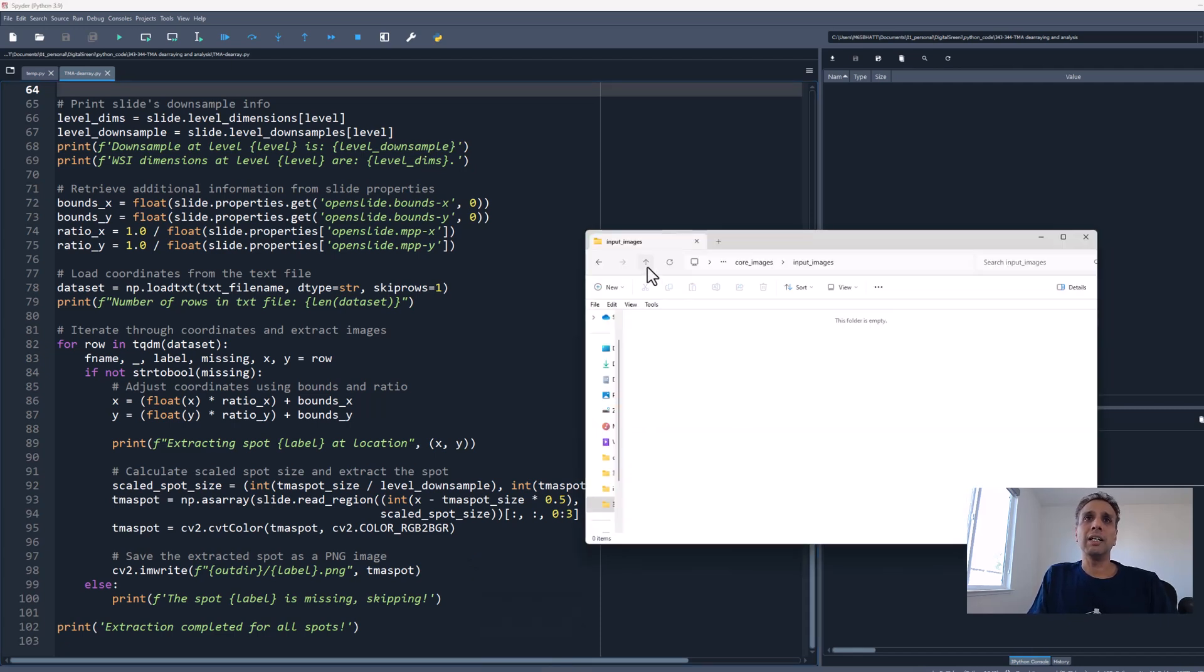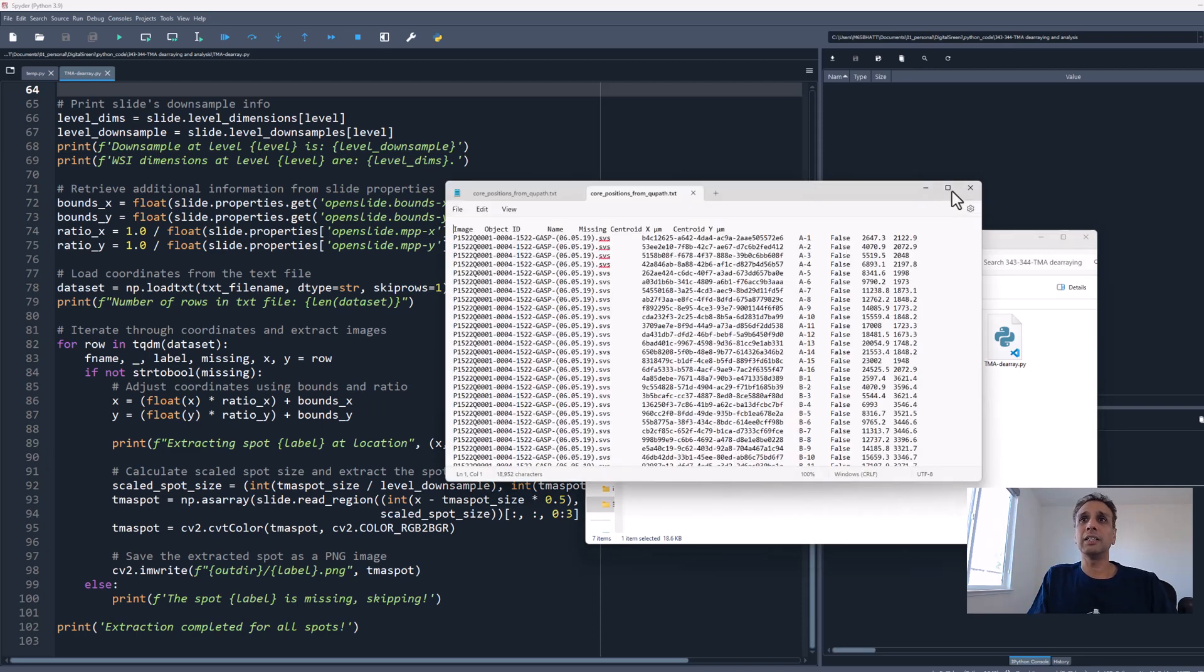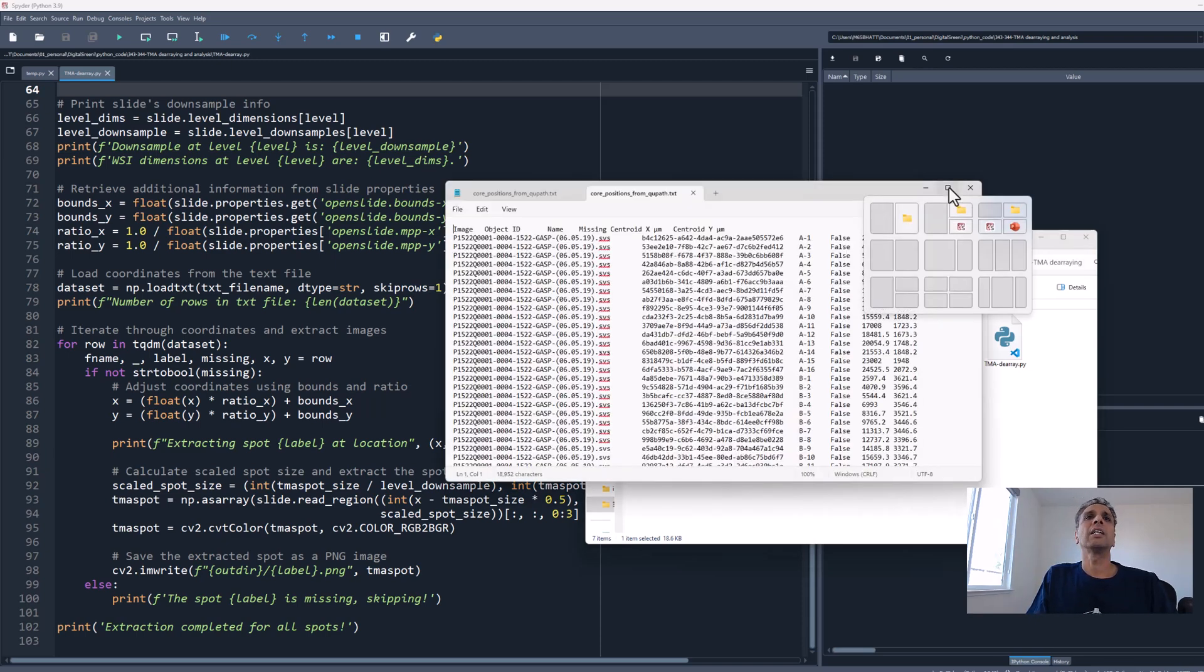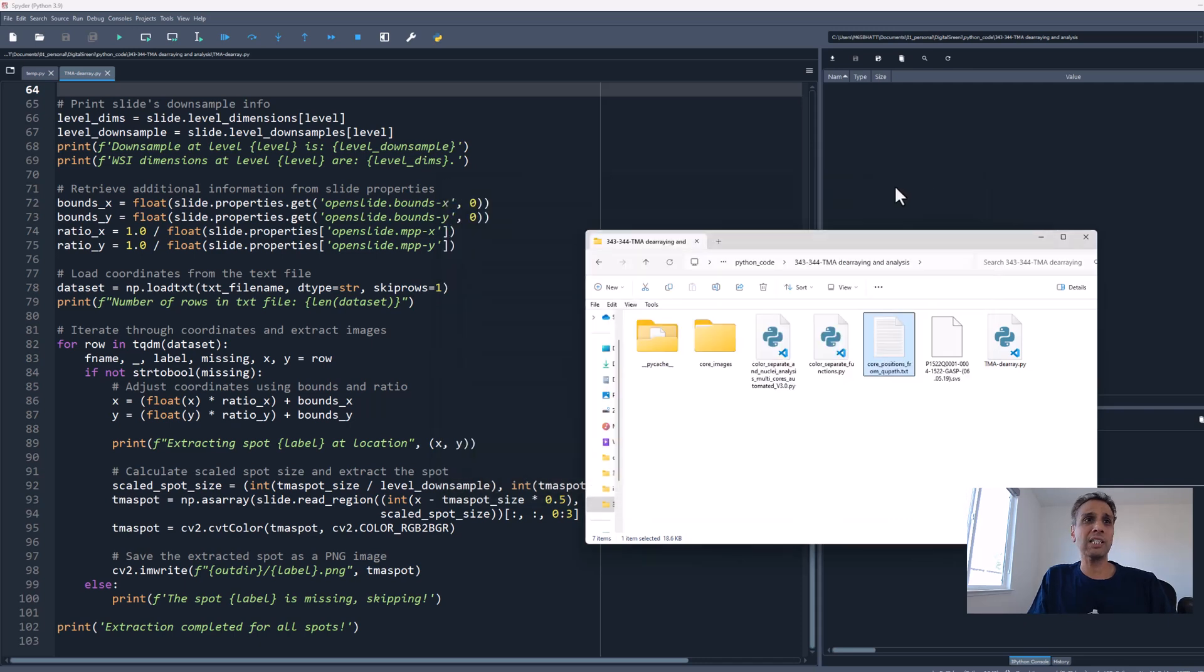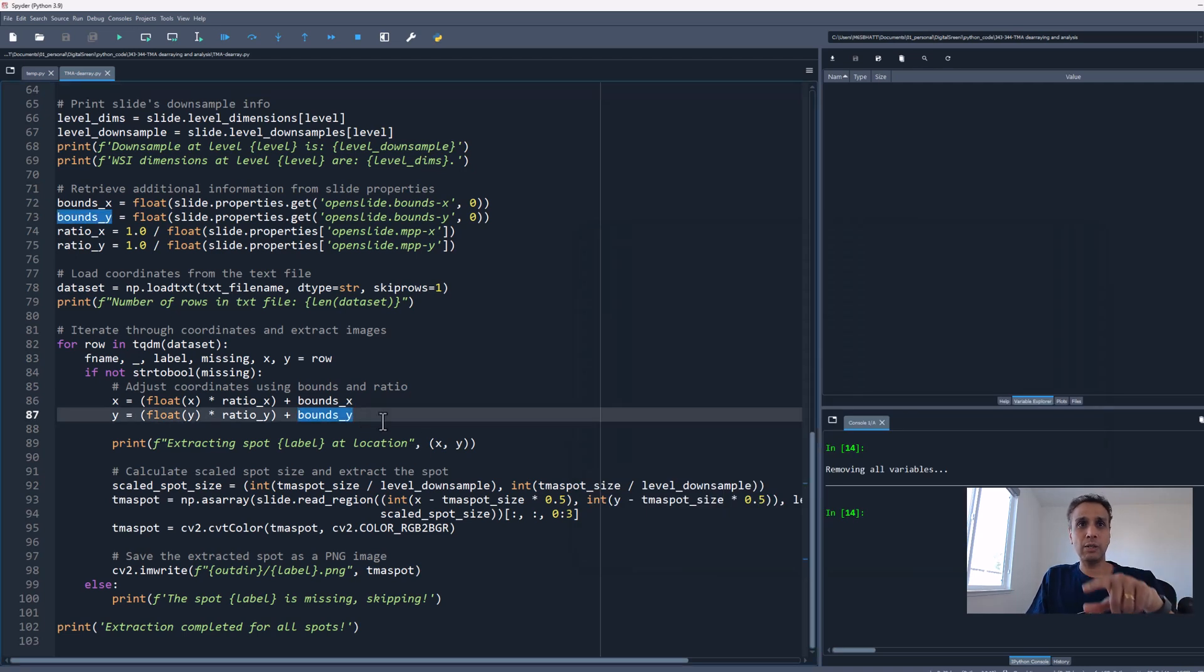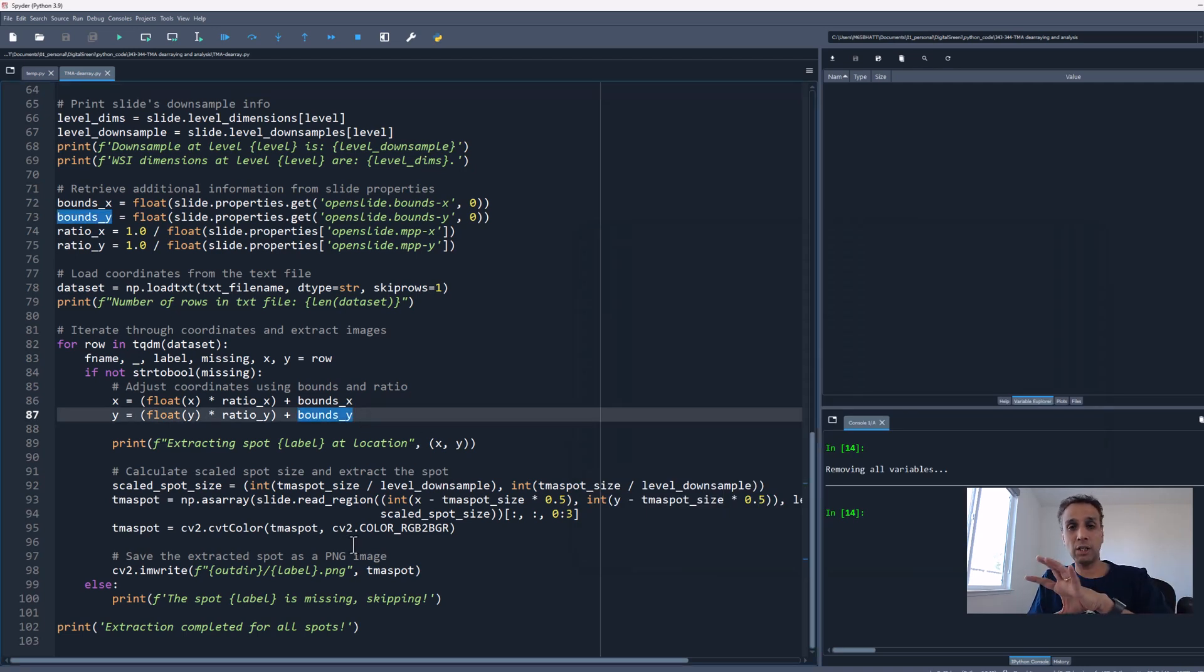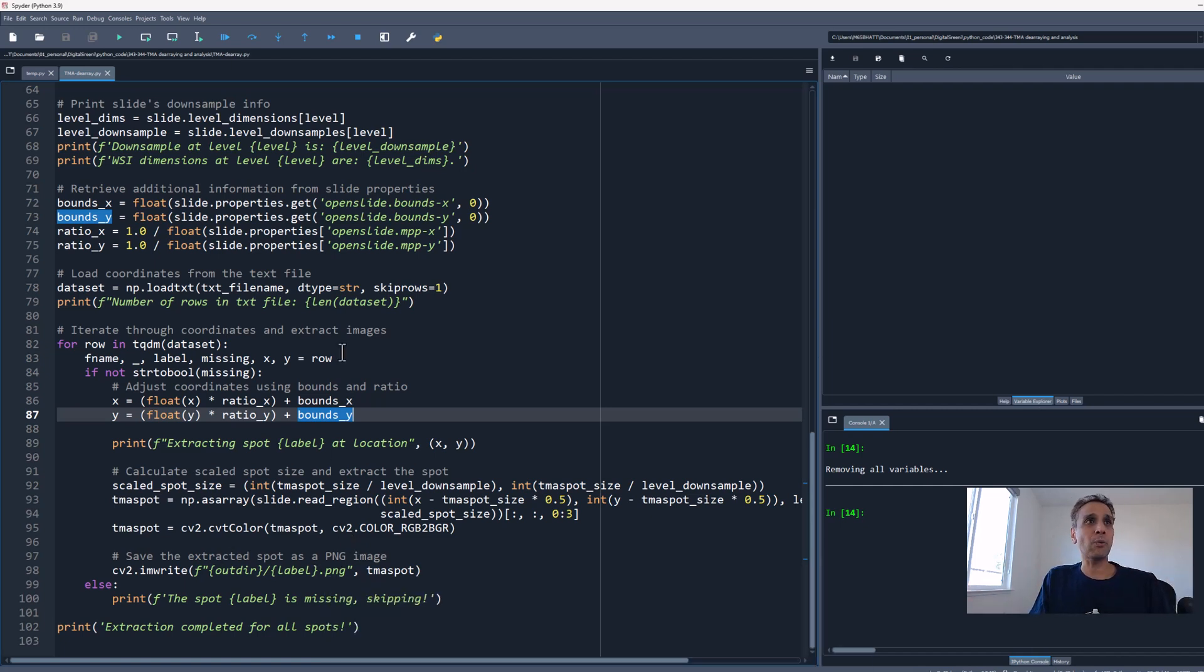From each row in the text file, we extract the label which is A1, A2, A3 and so on, and X and Y. Surrounding this X and Y, we get 3000 pixels around it and save it as PNG. That's it. Let's run it.